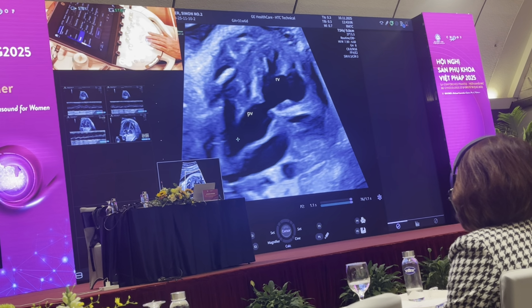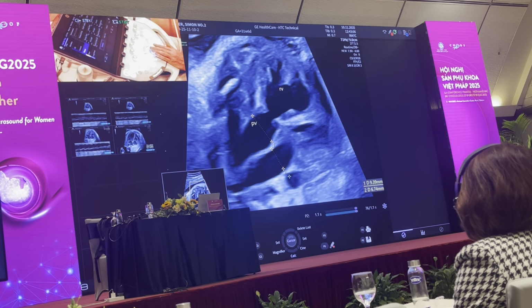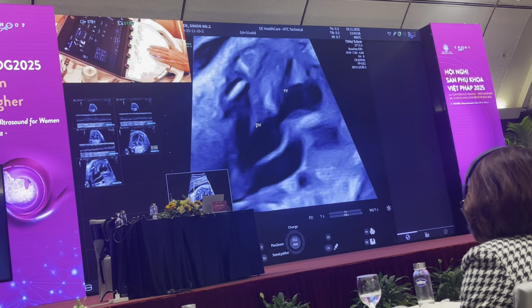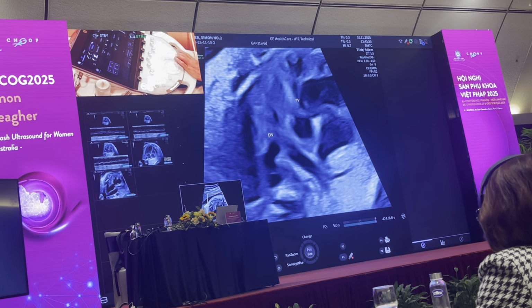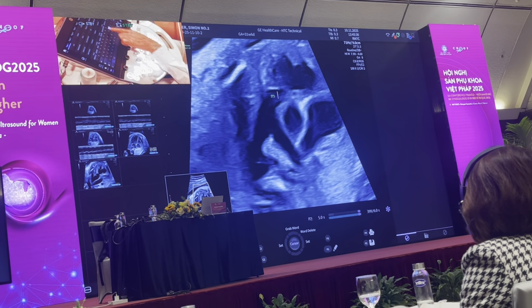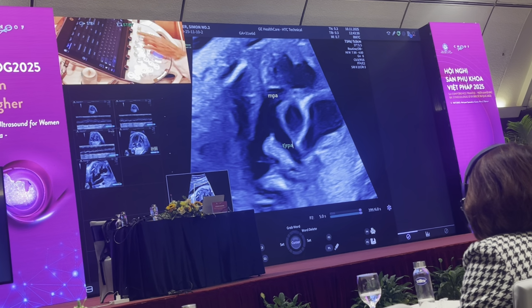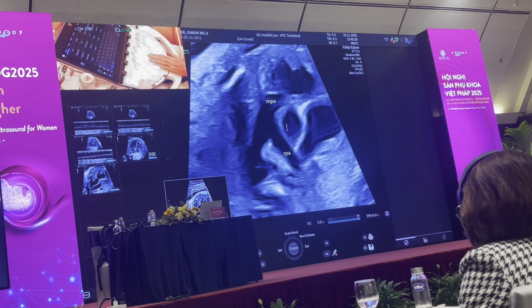And I look to see if there's any thickening of the valve. I look to see that the pulmonary artery is larger than the aorta, which is larger than the SVC. So the normal order of size, 3, 2, 1. And I say that to definitive review. When I come up to looking at the branching of the pulmonary artery, this is the main pulmonary artery here, coming out of the right ventricle, and then here, it goes behind the aorta.